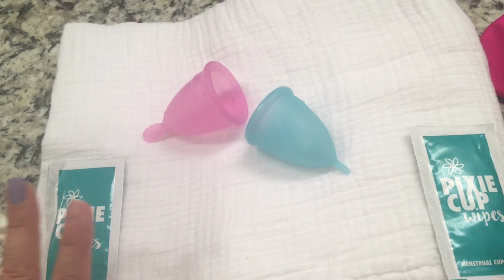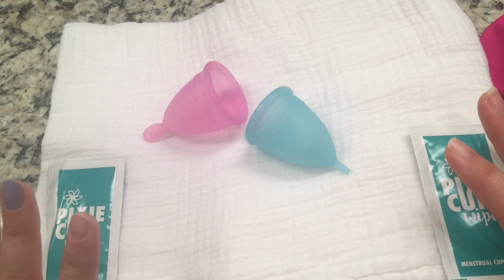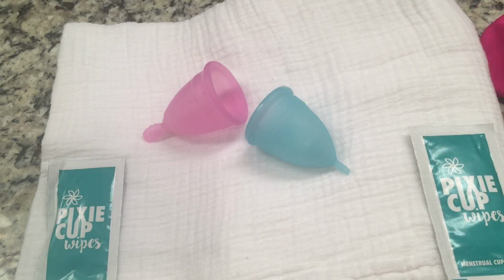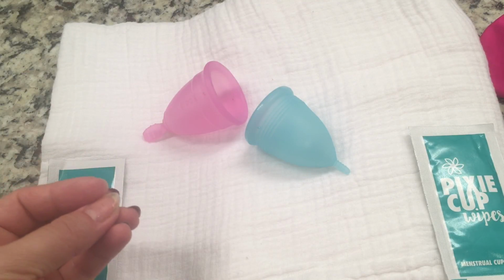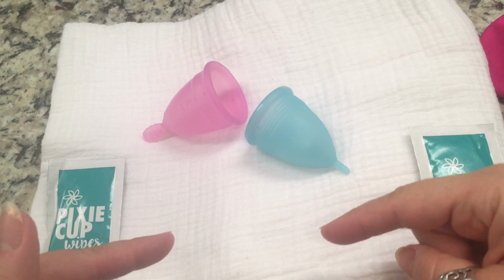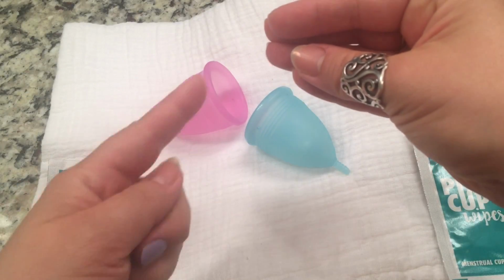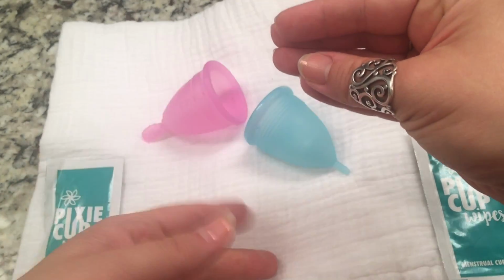So I really feel like for just being discreet and just feeling clean, this is a lot better. The only problem is going to be that when you're first getting used to using it, or if your cycle has started and then you're putting a menstrual cup in, there may be some of the menstrual fluid that's already down past your cervix, if that makes sense. Like the menstrual cup is up here and you've got fluid down here that's just going to come out.